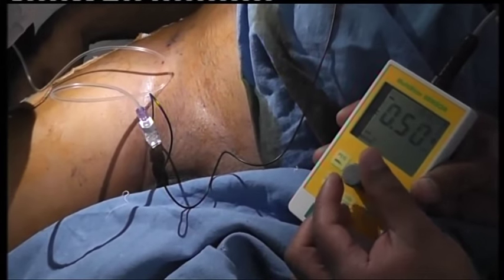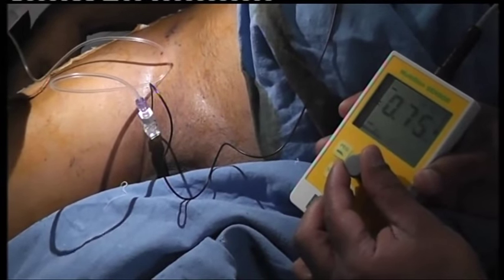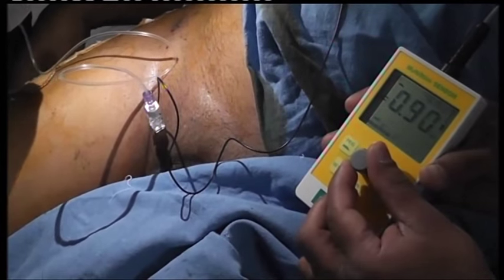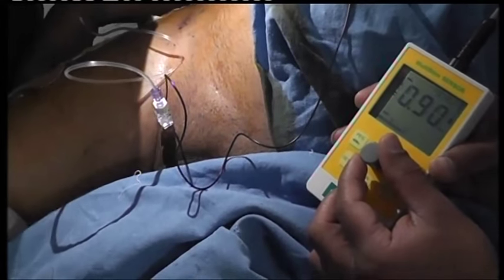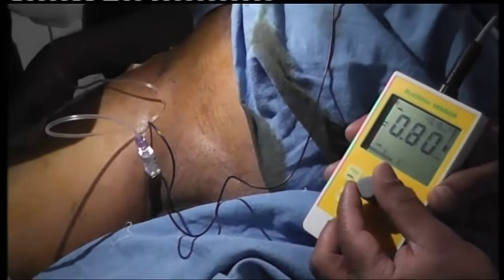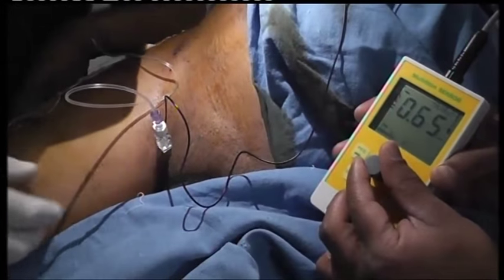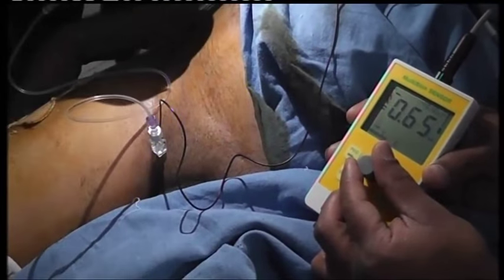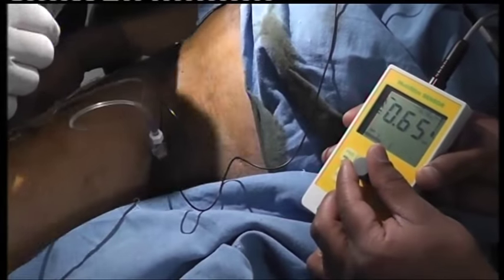That's fine. Go up again — it disappeared. That's it, 0.8 — that's fine. Go down. 0.7. It's disappearing at 0.7. We also have to remember that this patient had a spinal — you will get some more of it. That's fine, but it's in the right place.